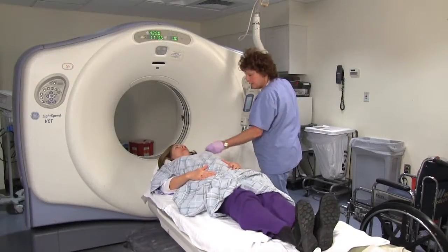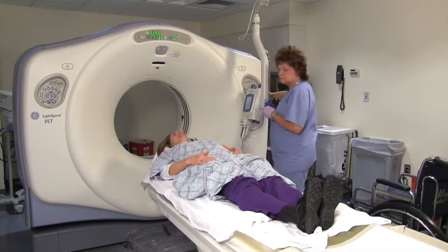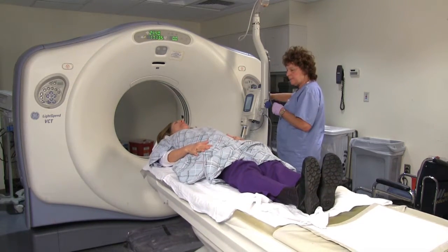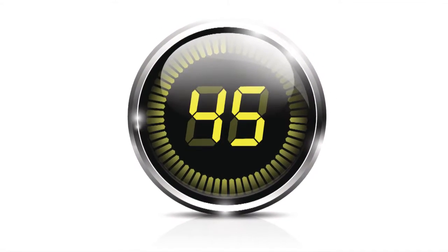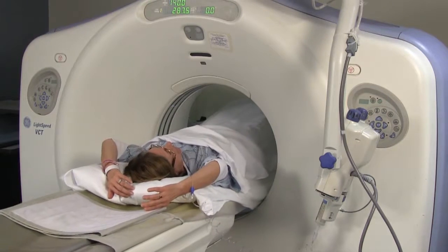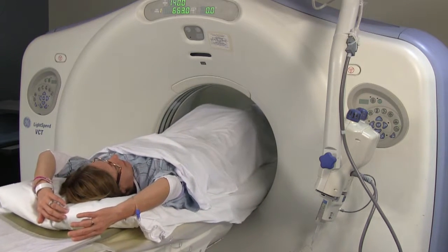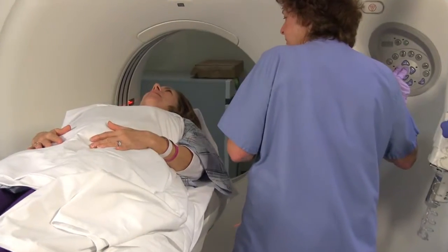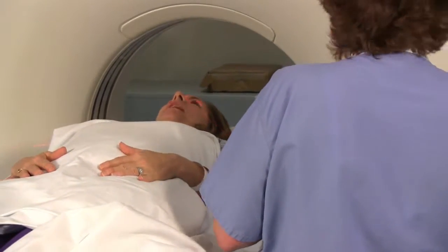During your exam, if you are receiving IV dye, you may feel a burning sensation in your groin, a warm flush sensation in your neck area, and you may have nausea. This sensation will pass in forty-five seconds. As with all x-rays, you will be asked to stay as still as you can during your exam so that your images are as clear as possible. In some cases, sedation and or blood work may be necessary.